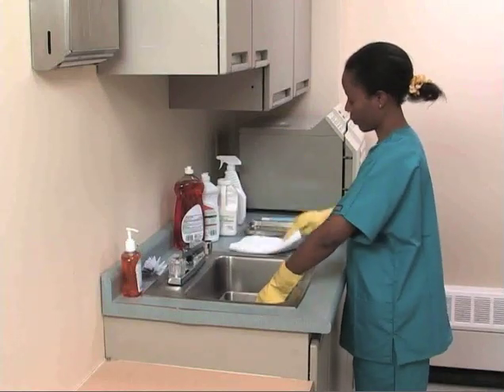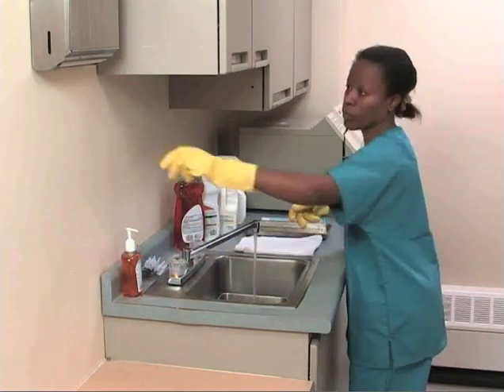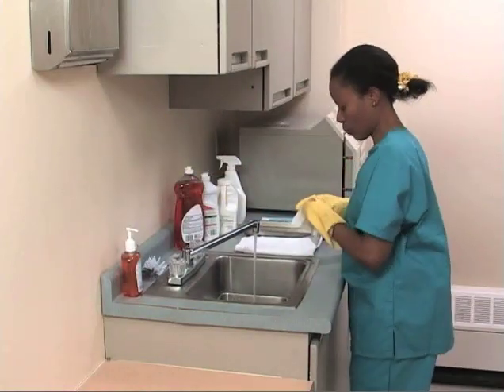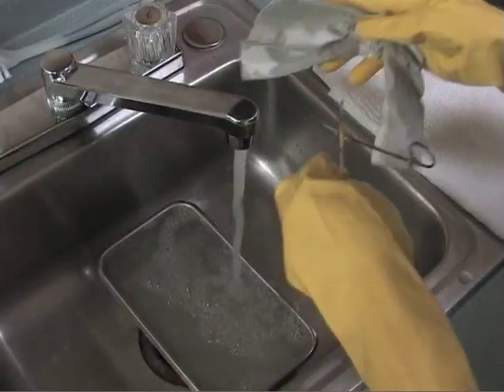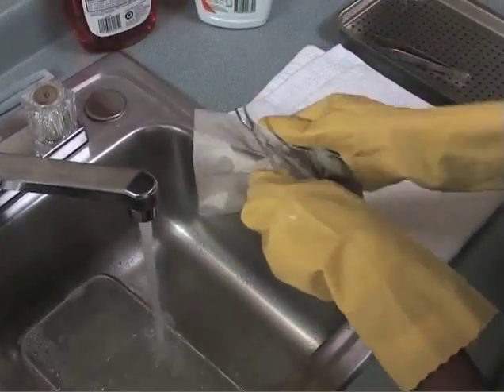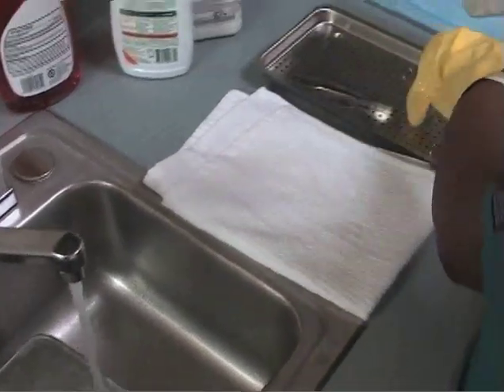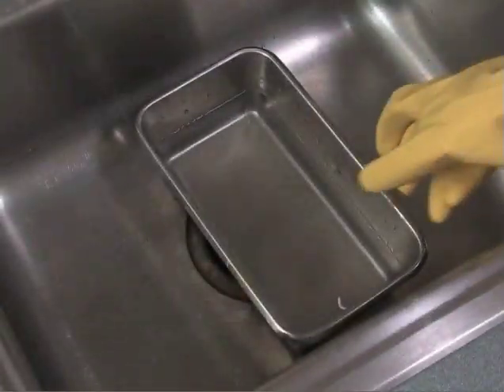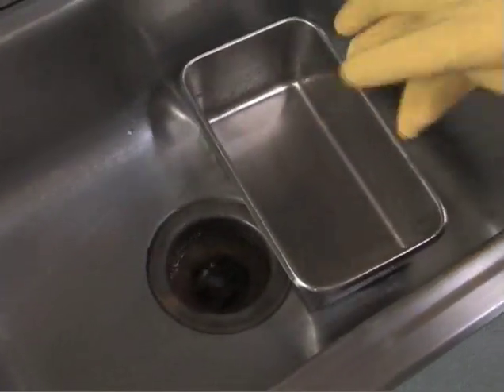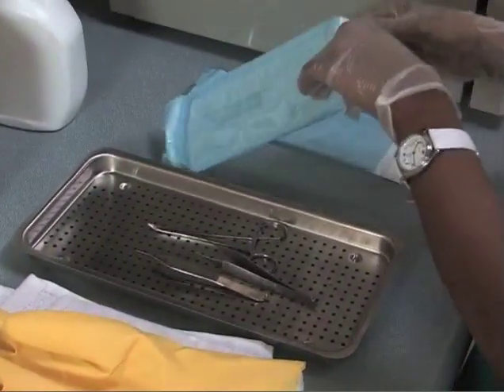Once the soaking is complete, remove and rinse each instrument thoroughly. Dry the instruments with paper towels. Dispose of the disinfectant according to manufacturer's instructions. Remove the utility gloves and place the disinfected instruments on muslin or into sterilizing packets for the autoclave.